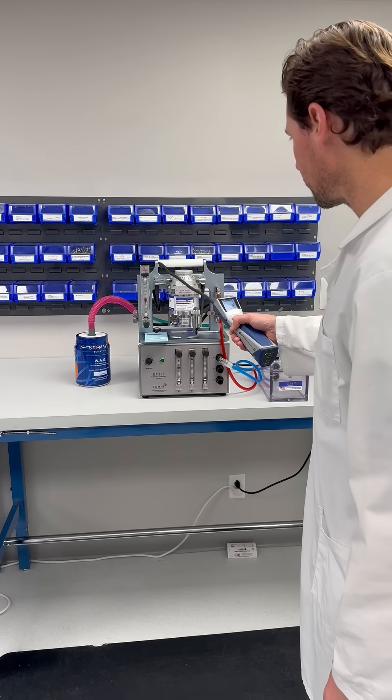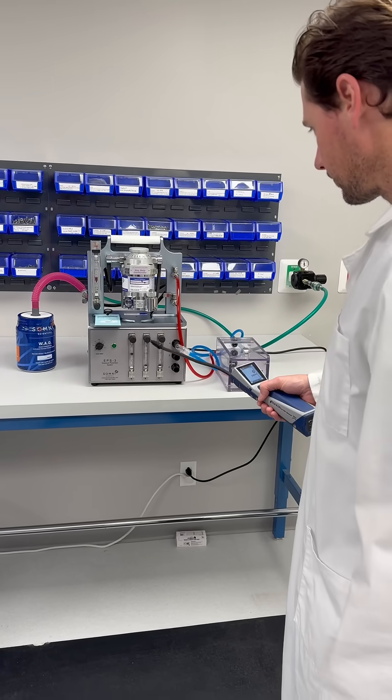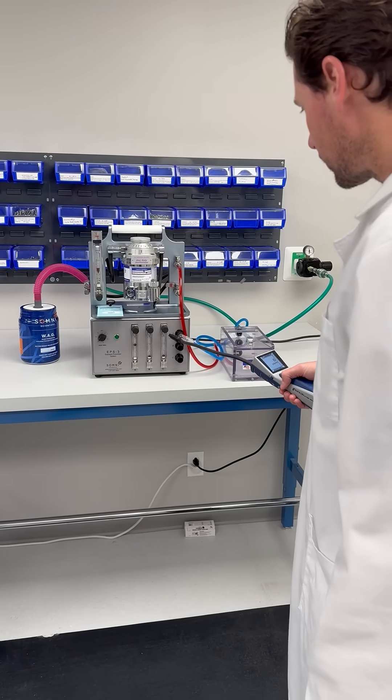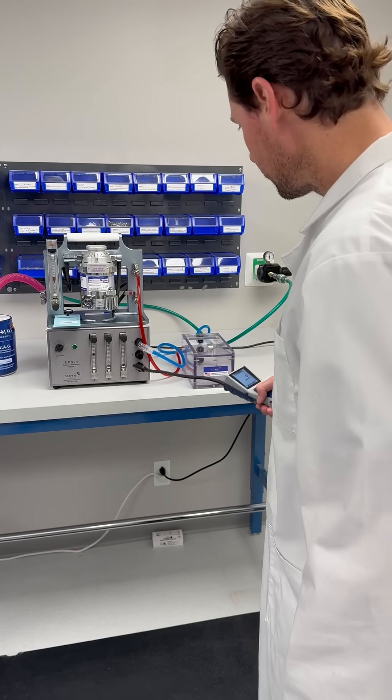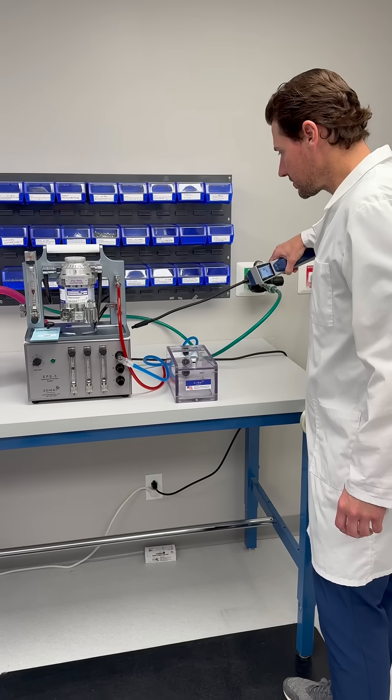Zero parts per million around the vaporizer. Zero parts per million around the vacuum scavenging system.